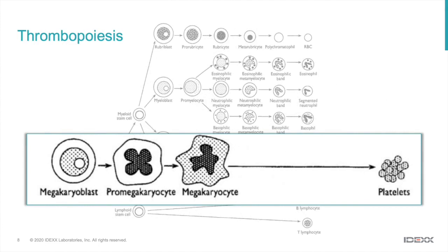If we zoom into the platelet production line, you'll see something dramatically different than most of the other cell lines. In the progression of maturation within this cell line, the cell gets bigger and bigger to the end point of the megakaryocyte, which is a very large cell that you'll see in the next image. And the platelets, the end product, are actually fragments off of the cytoplasm.